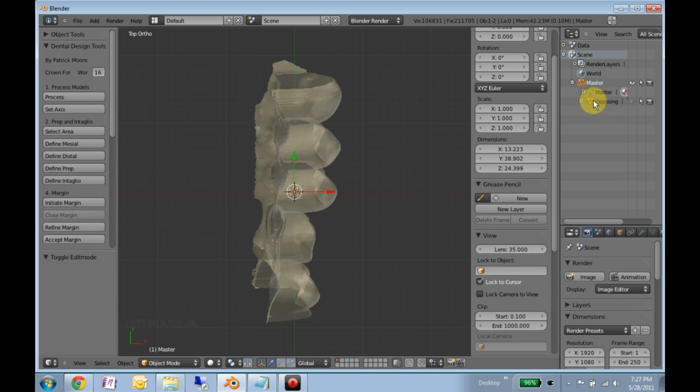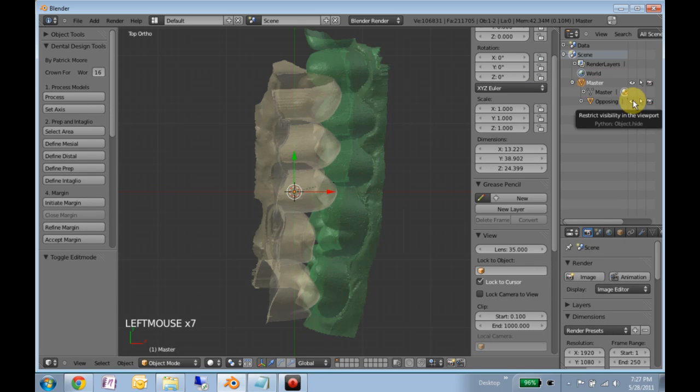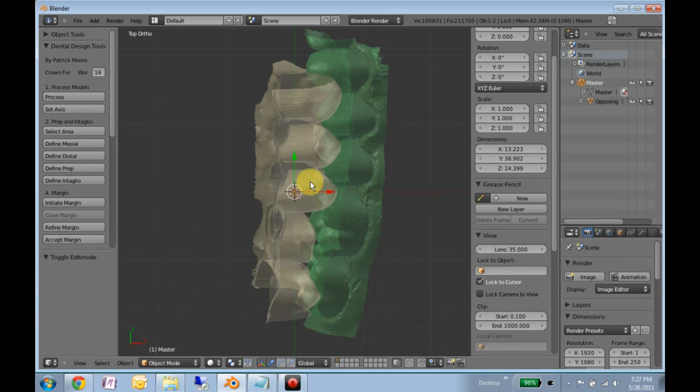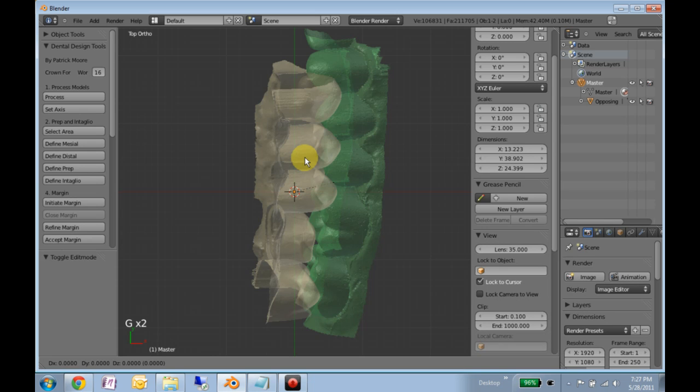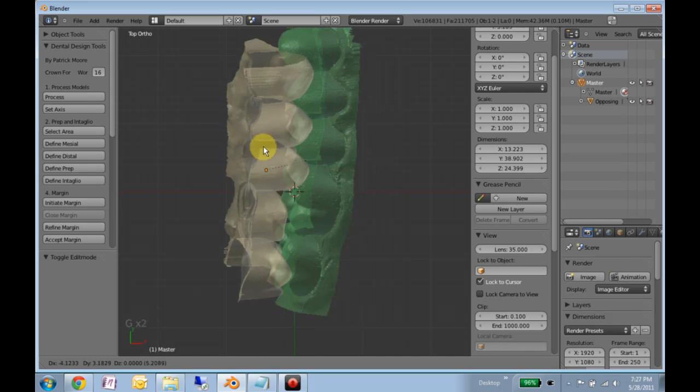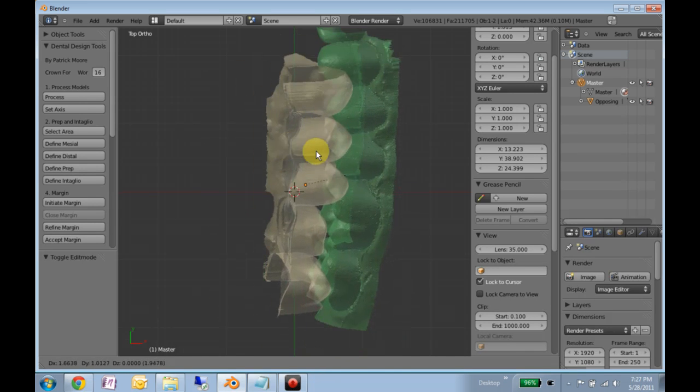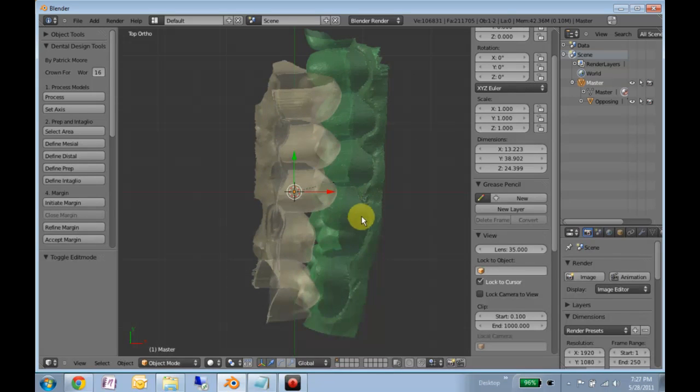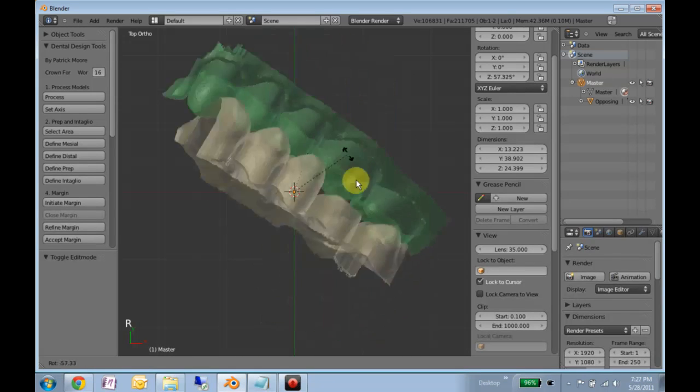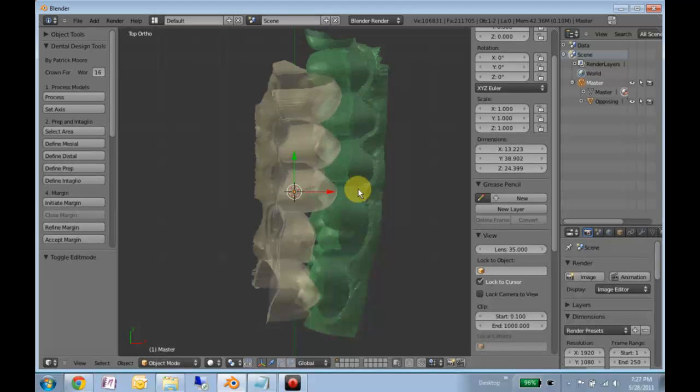So now we see that opposing is under master. It's visible here. And what this allows is if I right click on the master model, hit G to grab, and I move it around, the opposing model comes with it. Same for rotation, R to rotate.